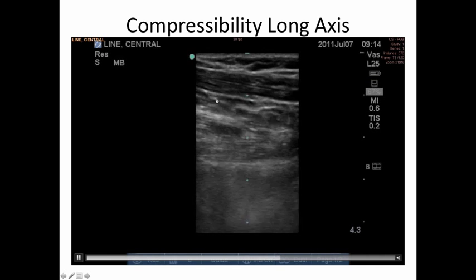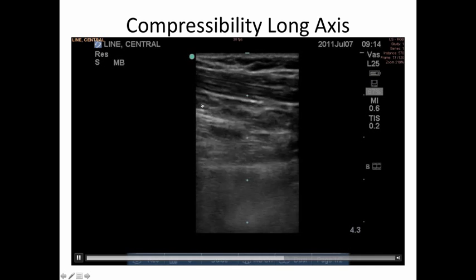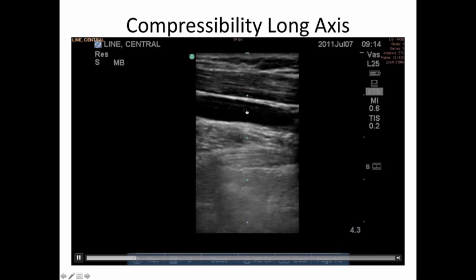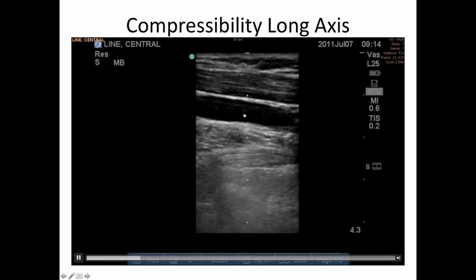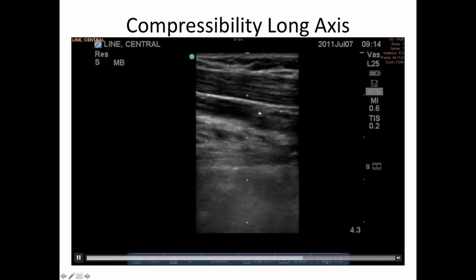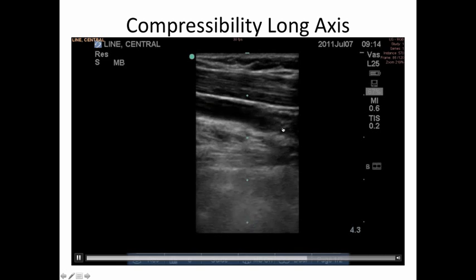You see here that in still image, it looks like there's that bright white of both vessel walls. As this person is compressing, which I guess was probably me, you can see that you lose that bright white, which means that instead of just confirming compressibility, you're actually sort of moving off of the vein. And so you should be able to see that bright white of both borders of the vessel in order to confirm that you're actually still on the vessel. Does that make sense?